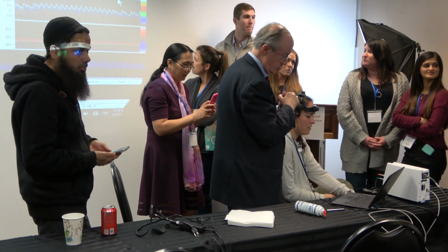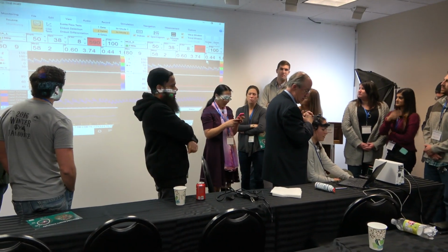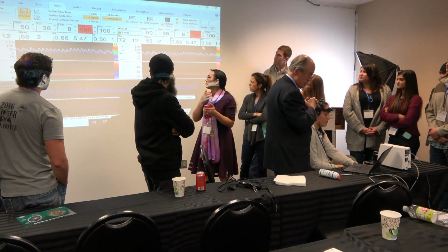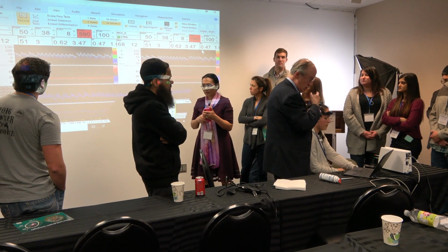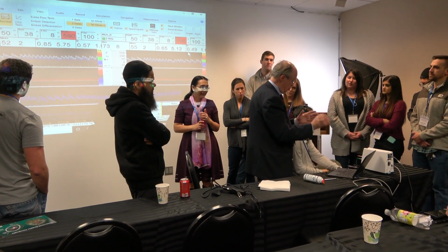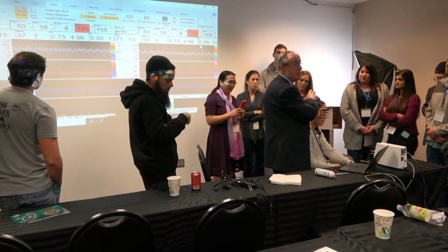Is this the right side only? It is left side. I'm sorry, left, yes, okay. Left side. Yes, I saw that. But again, as I mentioned before, I was not able with this new software to put right and left. Alright, so now on both sides we are seeing left side only.